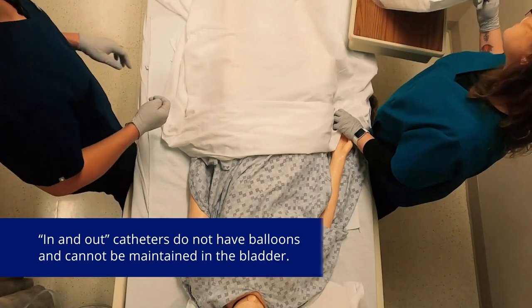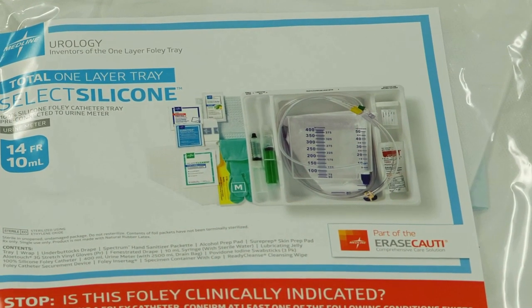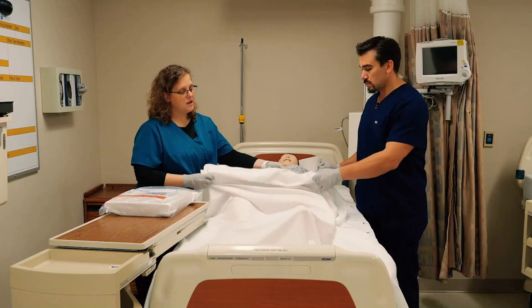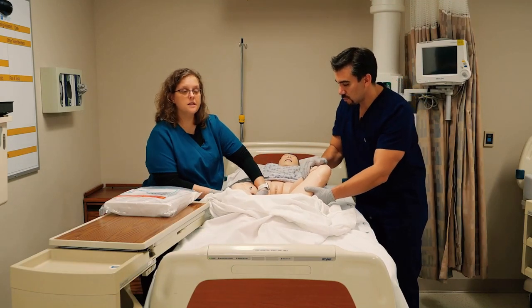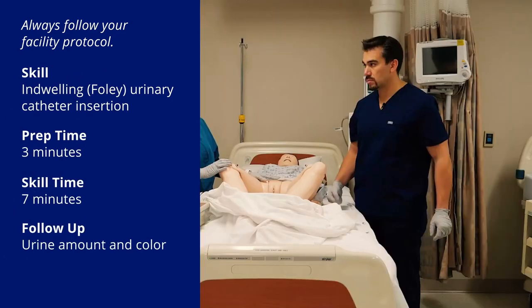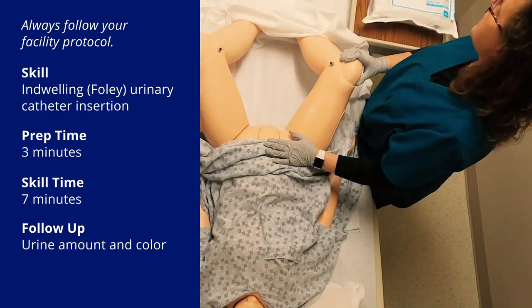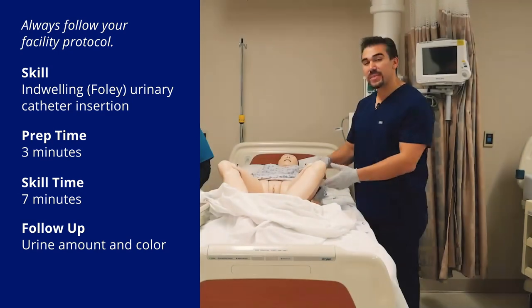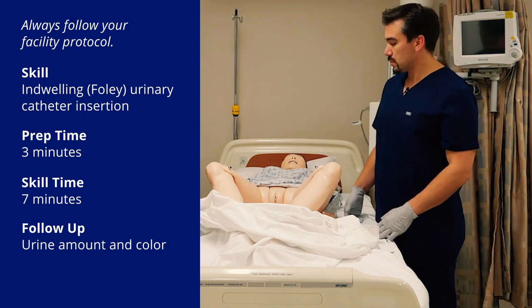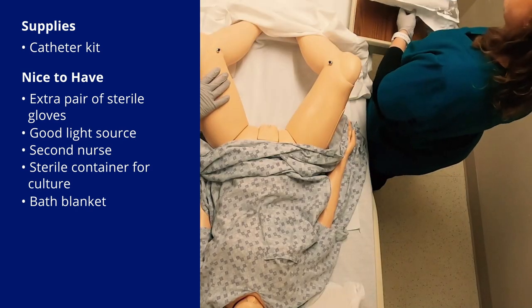It's important to know that these kits can vary somewhat, but it's going to tell you on the package what all is in there, and it's packaged in a way that you have the things you need first on top. We're going to get our patient ready — tell her what's going on, expose only what we need to, and get our legs ready. Many hospitals now require two nurses at bedside to place a catheter because CAUTI rates — catheter associated urinary tract infections — are so high. One of the biggest things is having the bed raised so that you're not leaning over and hurting your back. If you have a really difficult placement, you can put something under their buttocks to raise the urethra and meatus so that you can access them better.